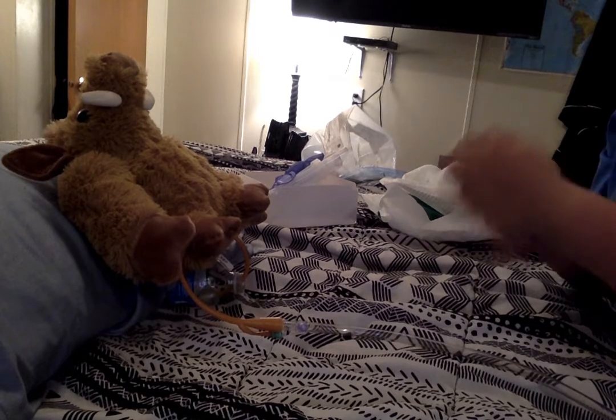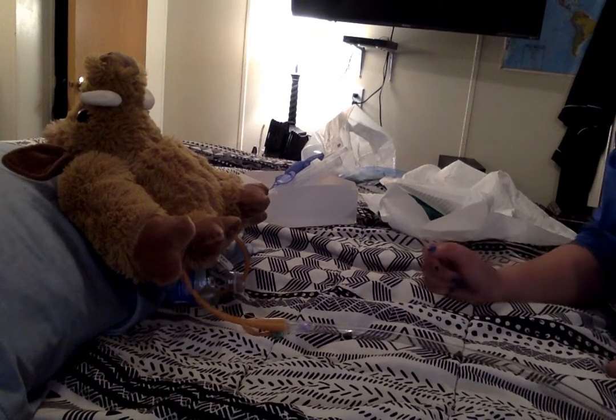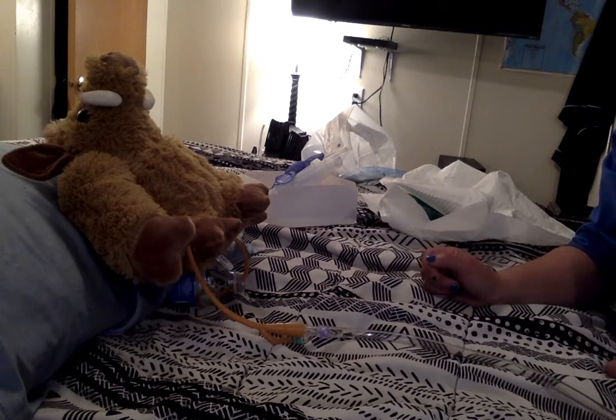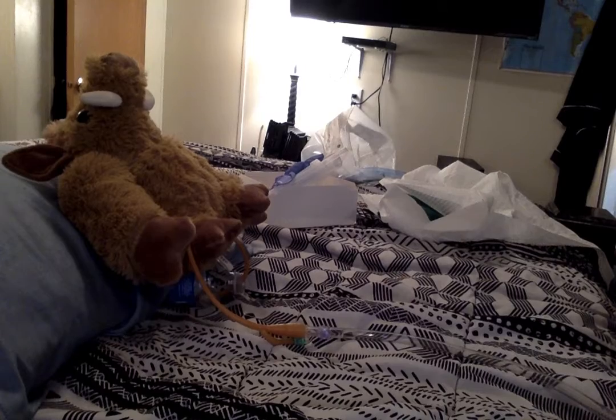We're going to perform our hand hygiene. We attach the catheter to the bed frame. We check the tubing to make sure that the urine is not obstructed and it's not kinked. We're going to help our patient into a comfortable position.